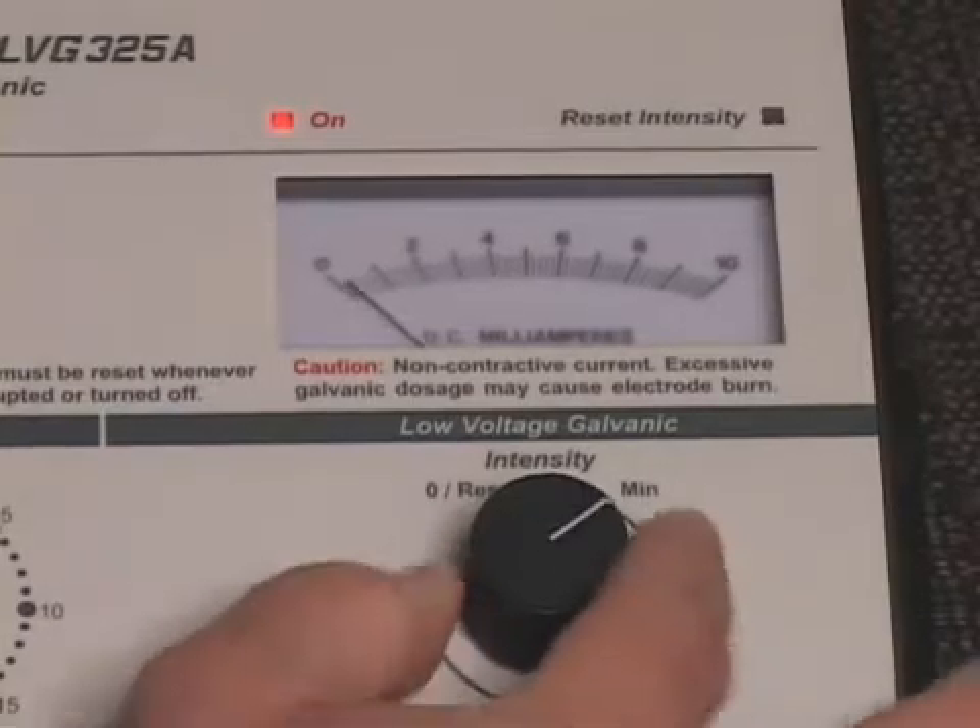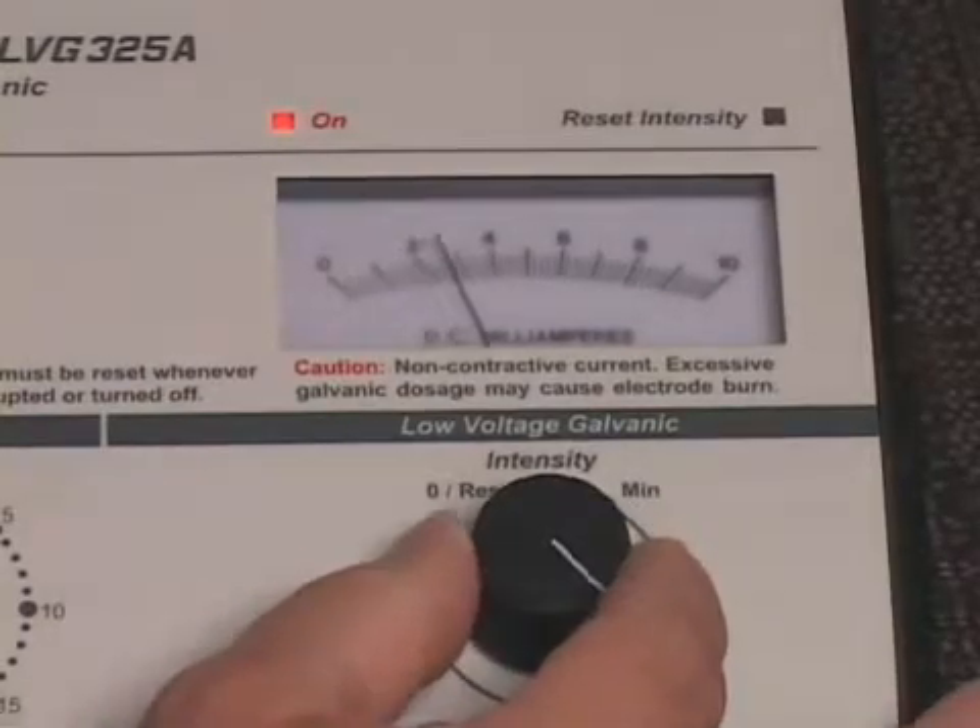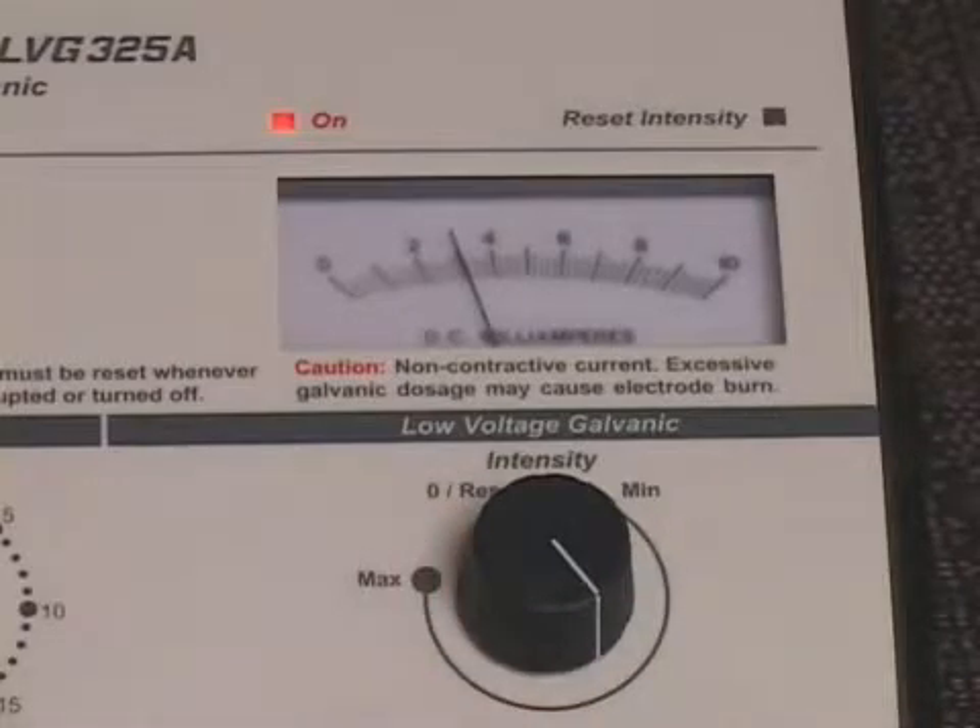Slowly increase the low voltage galvanic intensity control to the desired galvanic output level. The low voltage galvanic intensity control should always be increased gradually to avoid burns or trauma to tissue. If the low voltage galvanic reset intensity indicator light is illuminated, no output will be obtained until the low voltage galvanic intensity control is returned to the zero reset position, enabling the audible click.